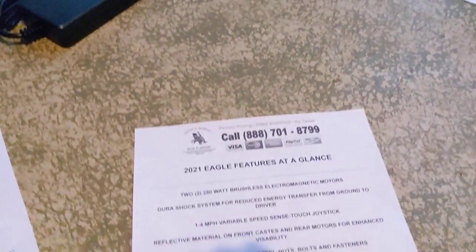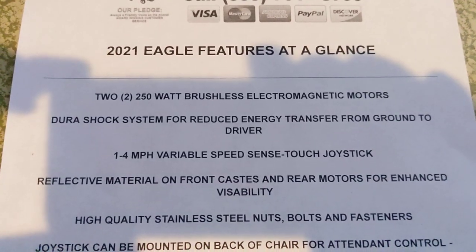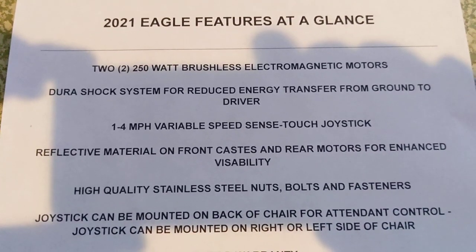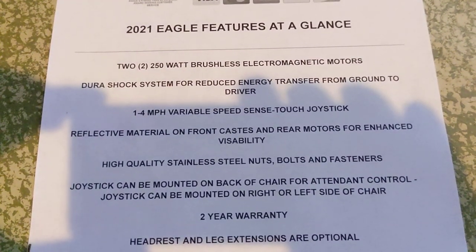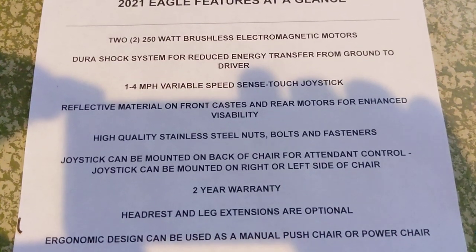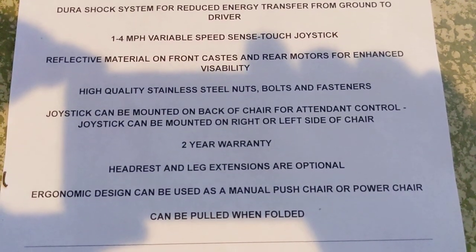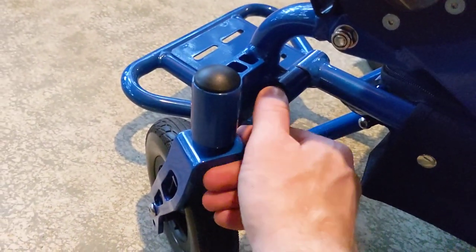Looking at the features summary: two 250-watt brushless electromagnetic motors, Dura-Shock system for reduced energy transfer from ground to driver, 1 through 4 mile-per-hour variable speed with Sense-Touch joystick, reflective material on the front casters and rear motors for enhanced visibility, and high-quality stainless steel nuts, bolts, and fasteners.